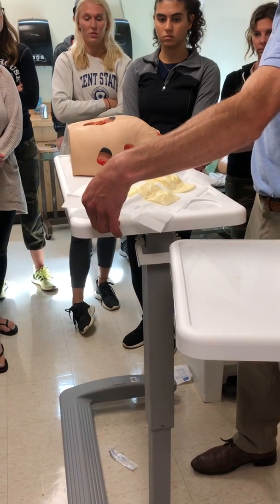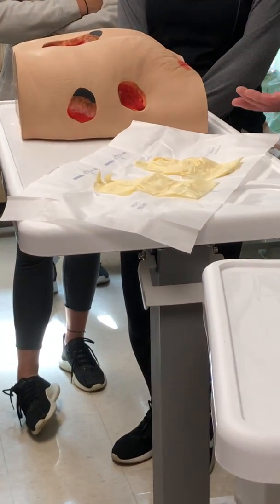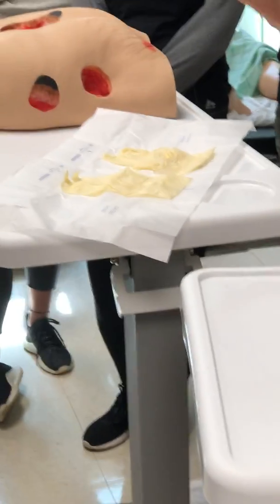I pull really hard to make sure that they don't flip back on themselves. You'll see all the time, nurses will do this, and then they'll flip out and hit the gloves. You broke sterile technique. They cannot flip back up, okay? Break the seams, take your time. Does it look like I'm in a hurry?